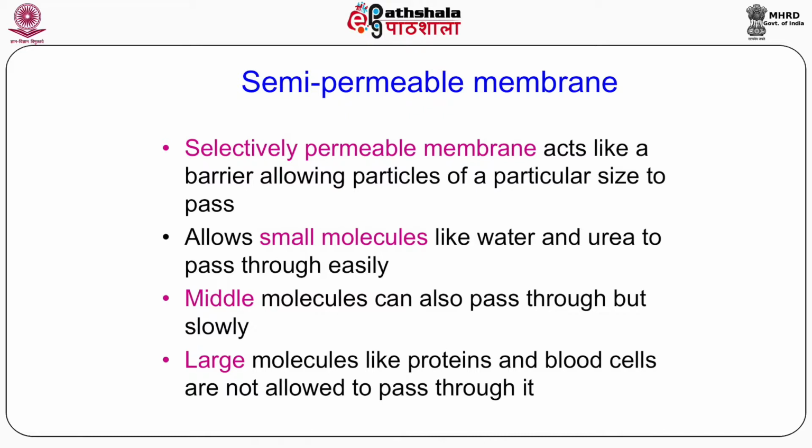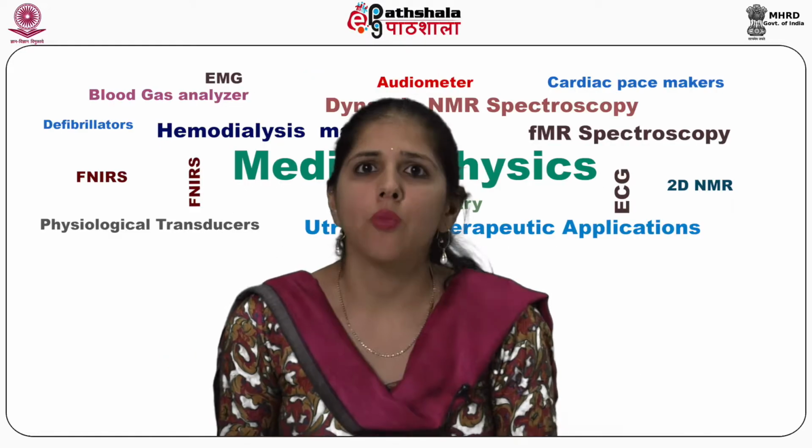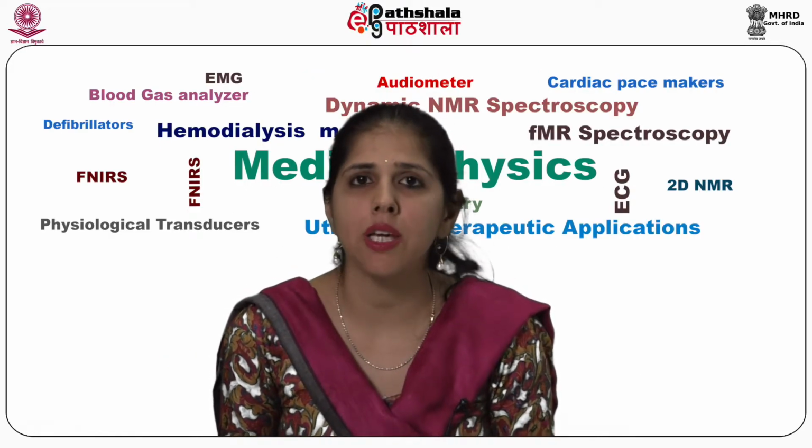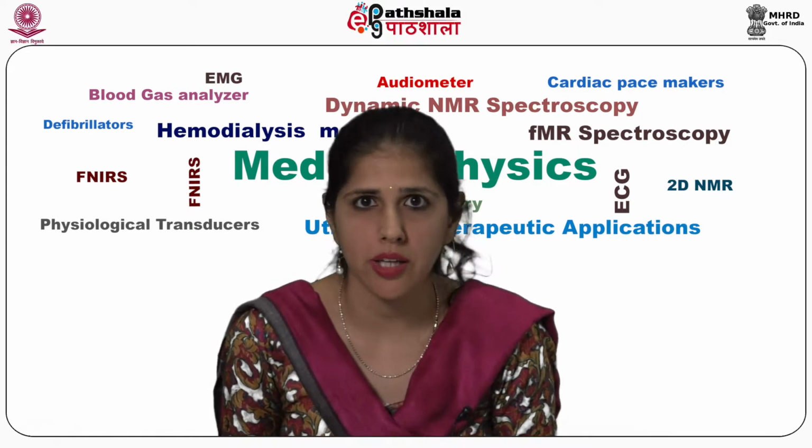hemodialysis. Now, newer membranes have a selective permeability to middle molecules also, which can pass across them, but they will move slowly as compared to small molecules because the movement is also dependent upon the size of the molecule. Now we will be discussing the hemodialysis membranes which are used for the process of hemodialysis.